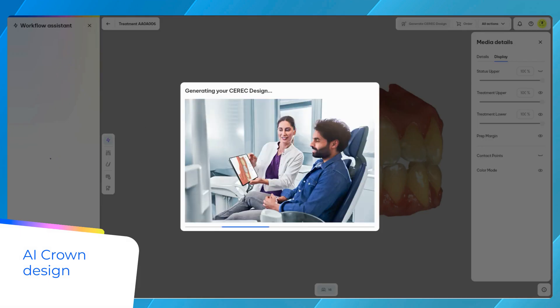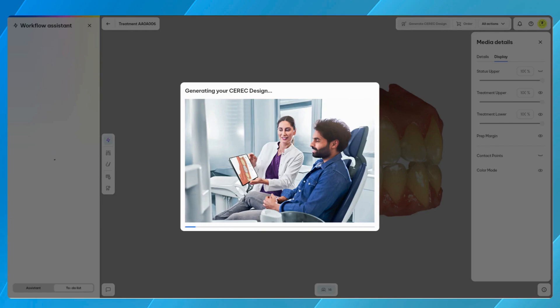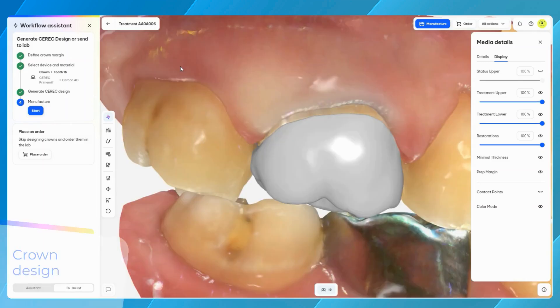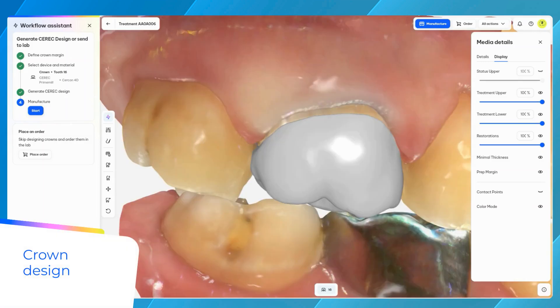At the moment, the calculation takes about 20 seconds per case and is based on our strong foundation of the proven biogeneric algorithm. Once the crown is created, the next step is to review and refine based on preferences.